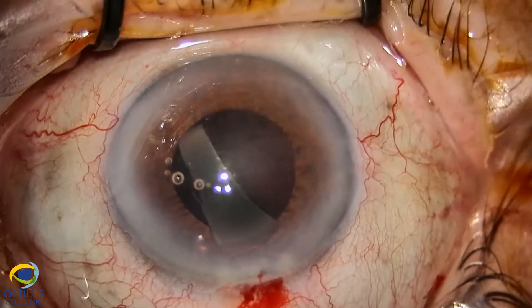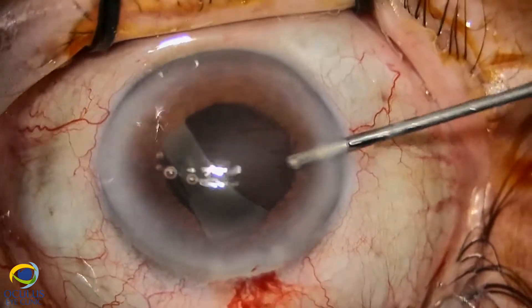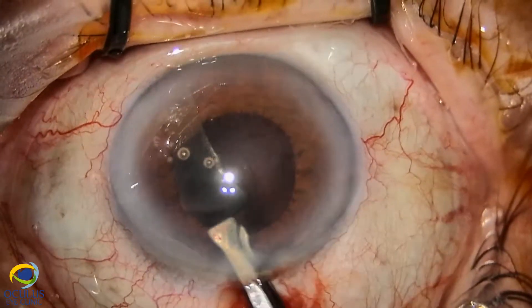In the pupillary area, and only after we performed this minimal vitrectomy, we safely withdrew the last piece of the IOL.